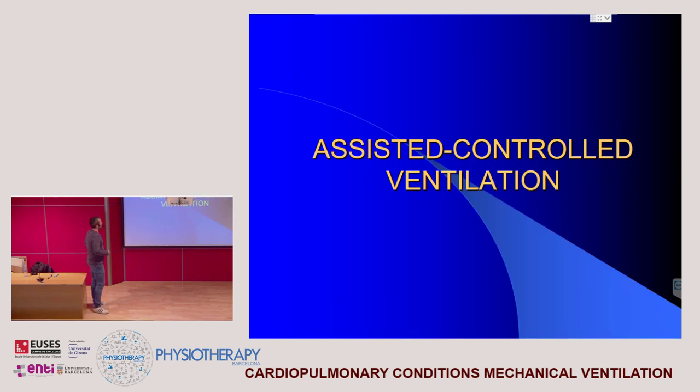Another type of ventilation is the next step, where the patient is not sedated or relaxed by drugs. It's a system for when the patient starts to wake up, so it starts to perform just a little respiratory effort, but very, very little.